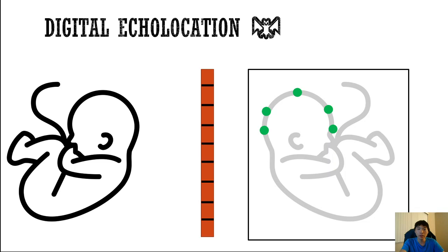These represent the boundaries between materials that have different acoustic properties. Ultrasound is really good at looking at differences in texture of the object, so different boundaries between materials that have different acoustic properties.